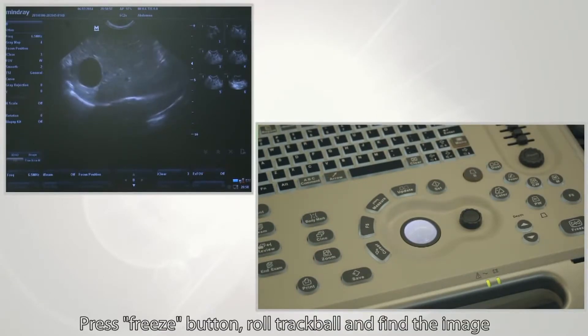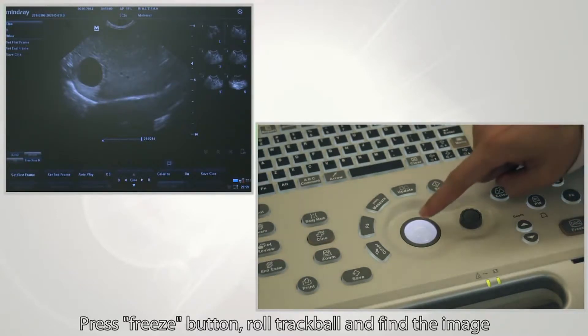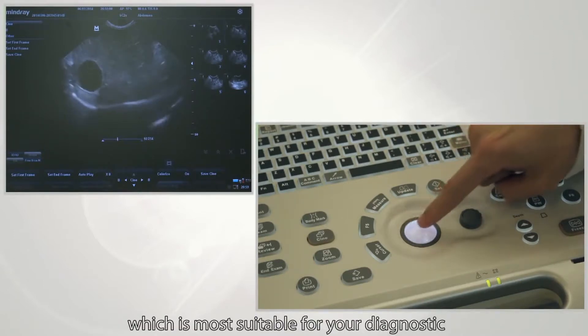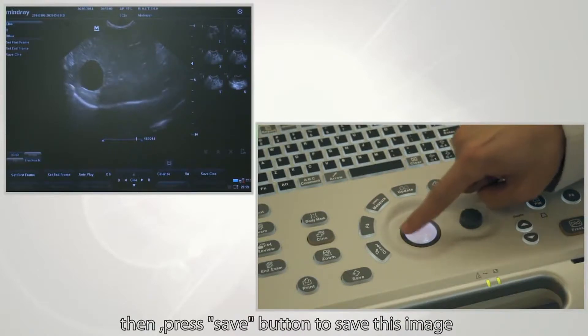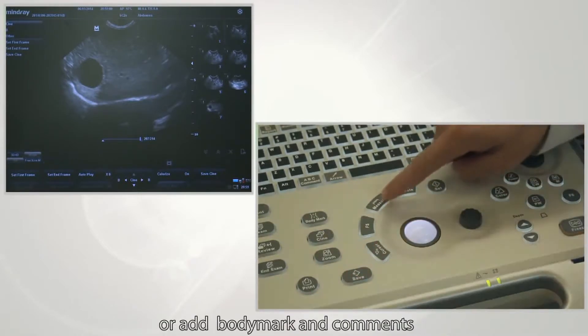One such parameter is the freeze feature. Press the freeze button, roll the trackball and find the image most suitable for your diagnostics. Then press the save button to save this image. In the saved image, you can also make measurements or add body marks and comments.